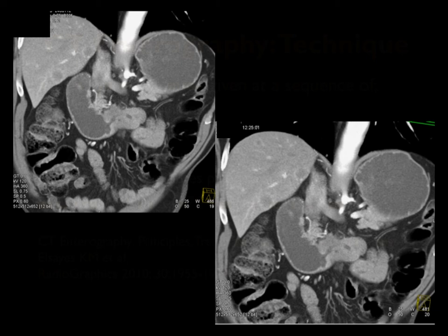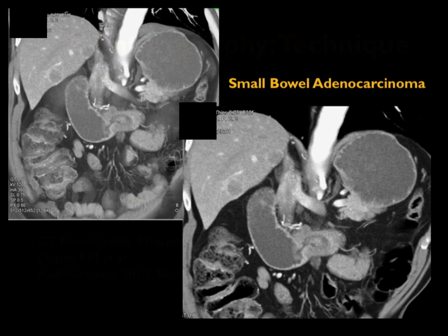Unfortunately, when you look higher, you can also see multiple liver metastases. So this patient, unfortunately, is too late to get resection and be cured. This patient had presented nearly 2 years earlier, and this is probably a classic example of why late diagnosis really limits your management.